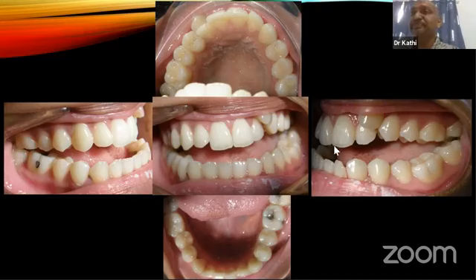This is how she is now. So we can see the face mask here. This is very recent, during the COVID era, I would say. So every patient comes with a face mask, not only the doctors wear face masks now. So this is the situation. We are trying to settle the posterior occlusion and get proper torque in the upper incisors. But we are getting there. We are improving the crossbite using some cross elastics. Use the button here to do cross elastics.